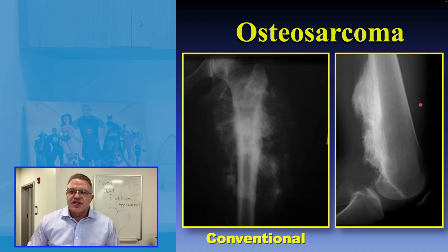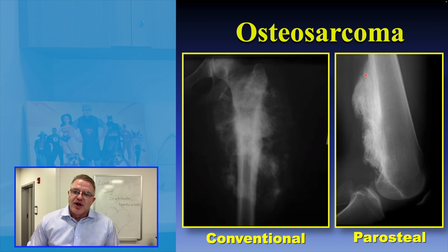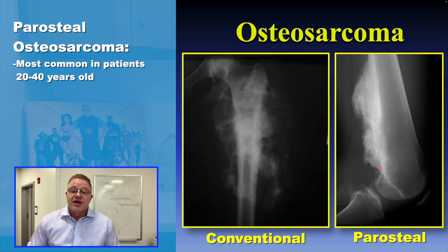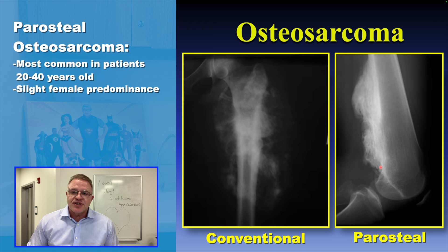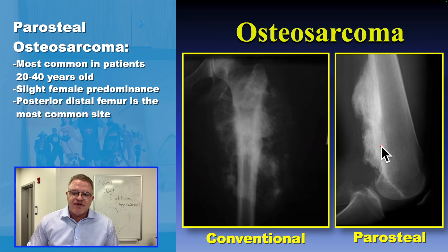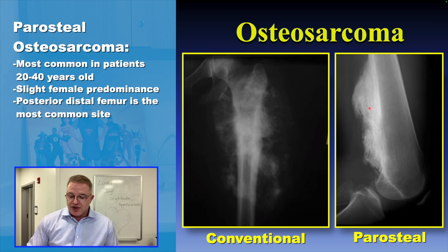The other image on the right is a parosteal osteosarcoma, which arises on the surface of the bone and usually affects patients between the ages of 20 and 40 with a slight female predominance. The posterior distal femur is the most common site — the back of the lower end of the femur, just above the knee. You can see this white density on the surface of the bone because it's a sarcoma that's producing bone.